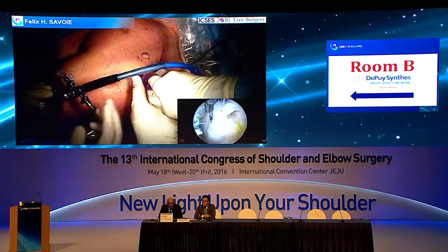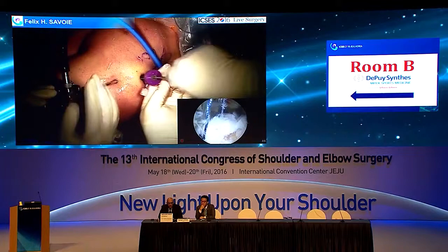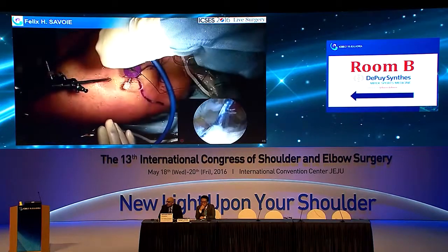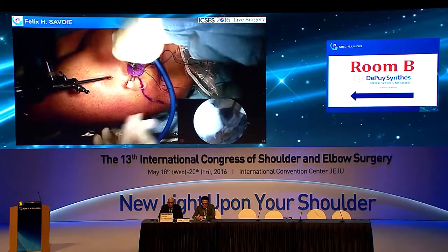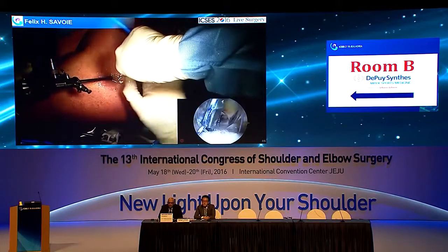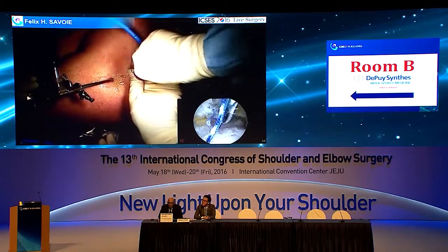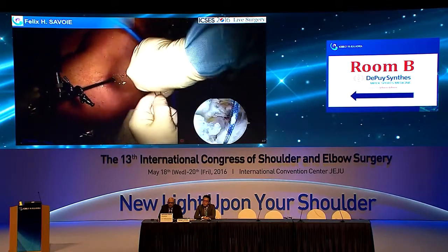Buddy, I was going to ask you a question about the critical shoulder angle. When you did your acromioplasty, is your goal to change that? I do. Yeah, we have a paper we're working on right now on it. I just learned this from Christian, and I have to give him all the credit in the world. I've always worked on the lateral acromion, but it was not based on any science. It was just based on the fact that I would see fraying, so I would take out the fraying. Then Christian put the science to it, and it makes perfect sense now, to me anyway, that that's what I needed to be doing.